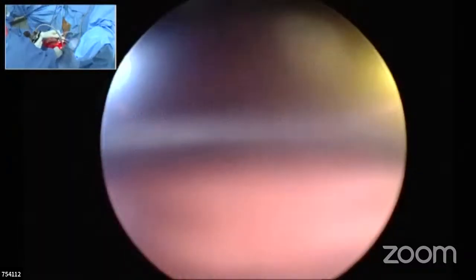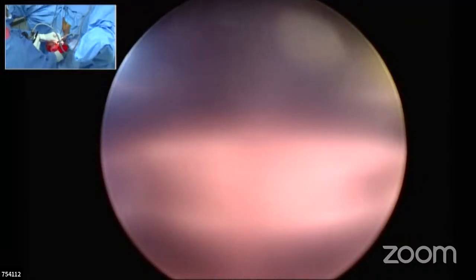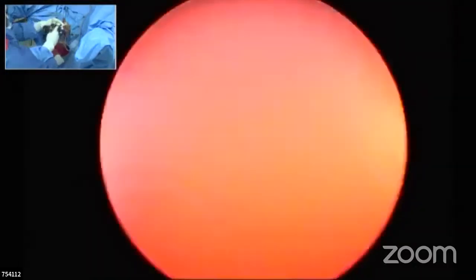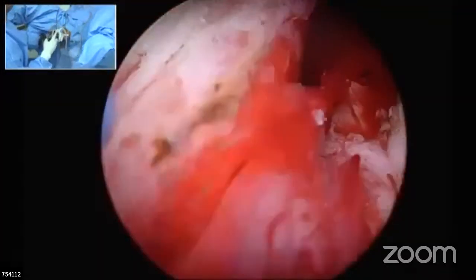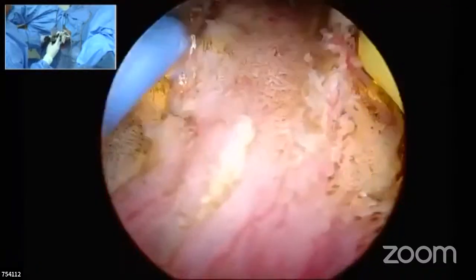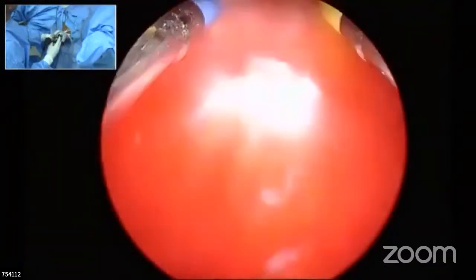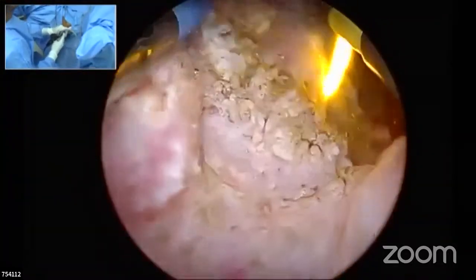But if you have to do an ejaculation preserving TUR, correct, this will change. Then you cannot resect that region. Yeah, this will change if you're going to have ejaculation sparing technique, in which case you will have to preserve the paracollicular and supracollicular tissue. Yes, you leave it intact. Sir, even that, you can still resect the apex perfectly well.